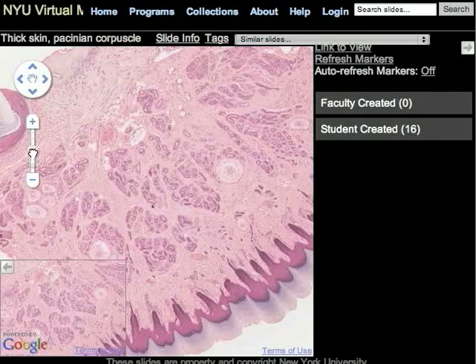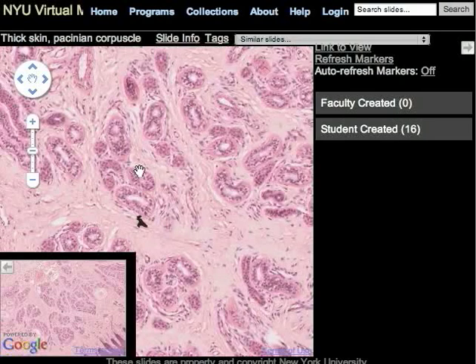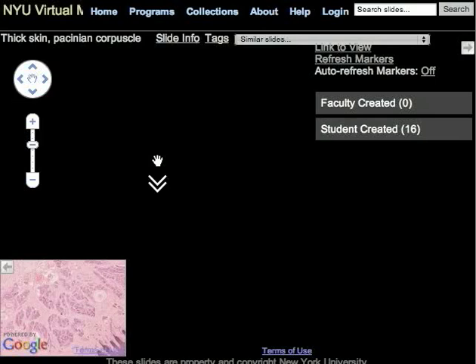But much like Google Earth, you simply move the magnification bar, and an image which is larger in size also appears. If you have a scroll mouse, you can also increase and decrease the magnification by using the scroll bar on the mouse, which is what I'm doing here.